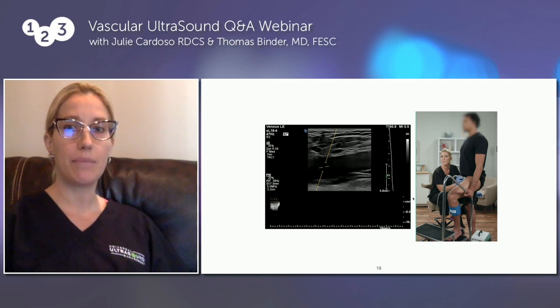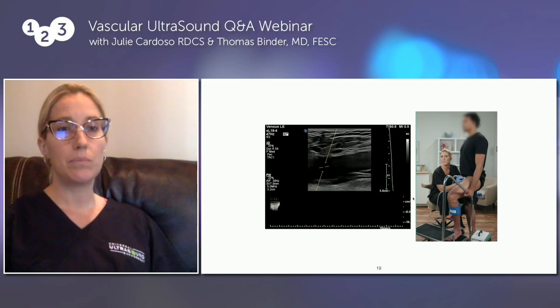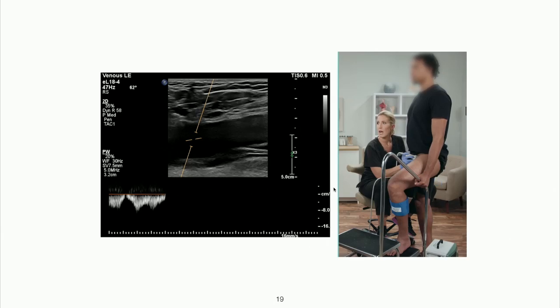So here's the clip. This lumen. I'm going to go ahead and perform a distal augmentation maneuver right now. Very nice. Go ahead, freeze that image. Perfect.